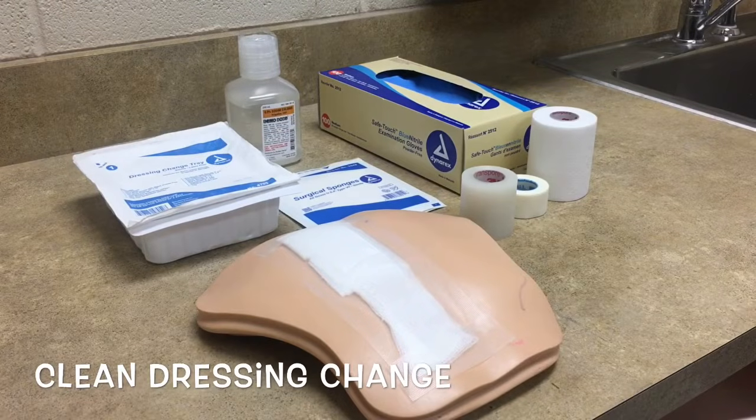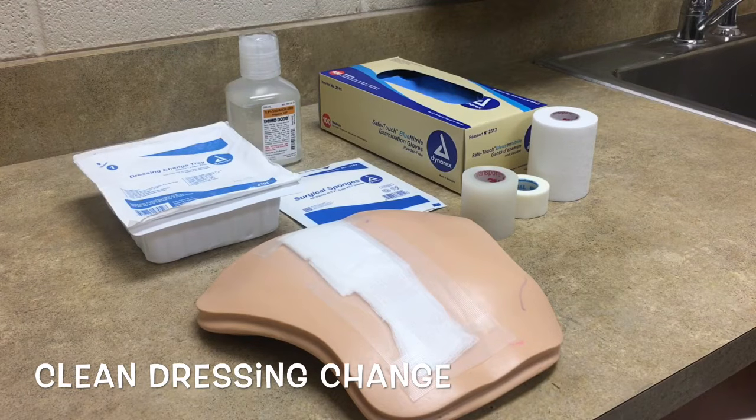Today we're going to do a clean dressing change for our patient. We want to make sure that we review the medical order for wound care instructions and assess the patient for need for non-med and med interventions before the wound care dressing change. We would also want to check for allergy.